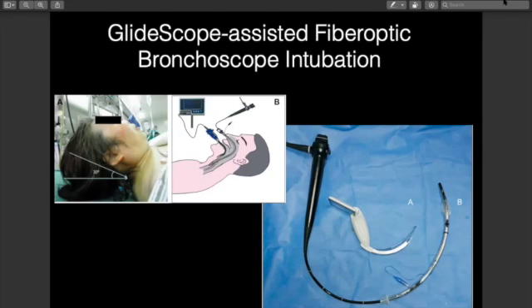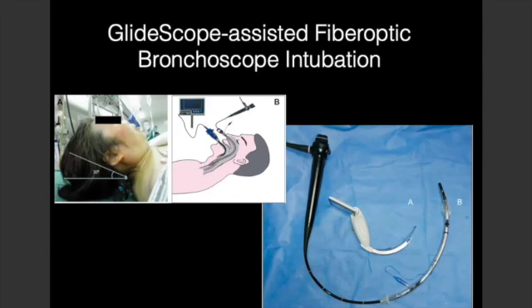So how do you tell if they need BiPAP? You'll put the mask on them. You'll let them spontaneously breathe, you'll watch their tidal volumes. Then you'll close your pop-off and slowly go up to 5, 10, that's CPAP. And if you notice their volumes are much better, then give them 10 of CPAP in recovery. Or if you notice that you have to give a little positive inspiratory pressure to get a good volume, well, that's BiPAP. So maybe figure out what is the optimal setting there and call respiratory to bring down the BiPAP to have that for them in recovery. And that will be a bridge as the anesthetics wear off for them to maintain their carbon dioxide.